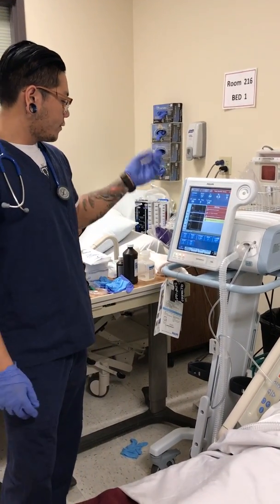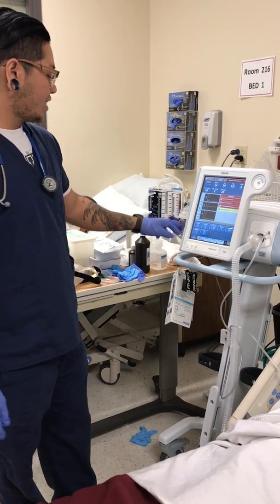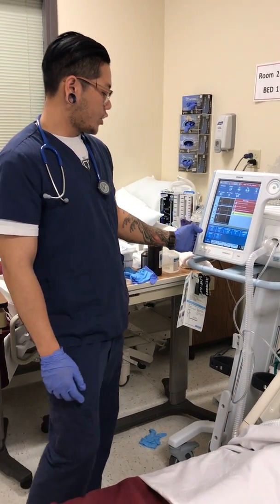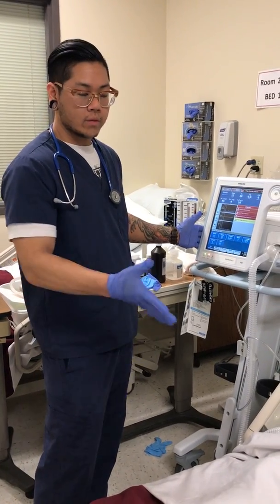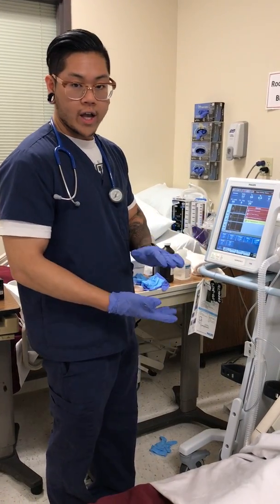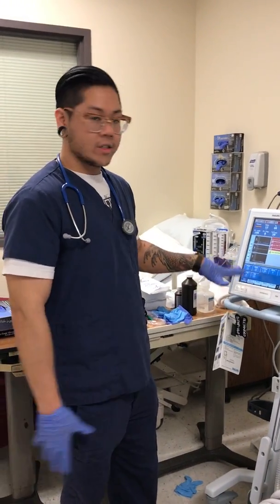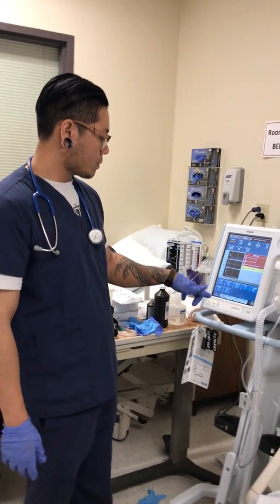So if the patient was having a carbon dioxide problem, CO2, then you'd want to increase the IPAP, and it's going to help with their CO2 levels. But if they need oxygen, then you're going to increase your EPAP. Say if they need oxygen, you're going to increase the EPAP to 3, but their CO2 is okay, so you're going to increase the IPAP as well to 3. That will keep delta P the same. It's going to be a good tidal volume, and they only needed oxygen, so that's what that's going to do.